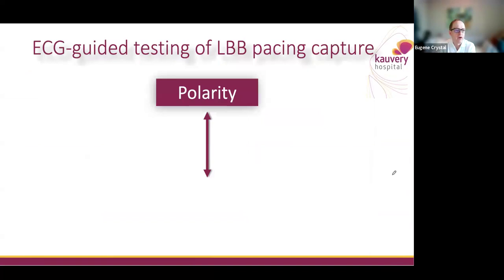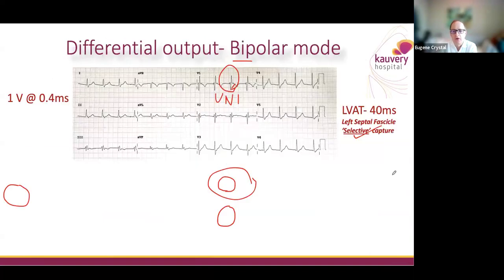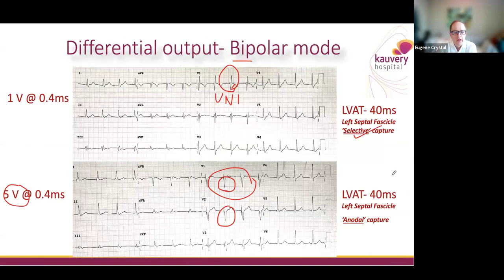I think a very brief thing. If you deal with a non-responder to CRT-P or CRT-D, obviously you have to spend a little more time because it's the only modality at the moment to help this patient. But in all other cases, over-manipulation of the lead can lead to its own complications related to the mechanics of the hardware you use in particular. And I hear that some operators say if they manipulate a lead for about 15-20 minutes, they know they need to replace the hardware altogether. So I will just stop right there.